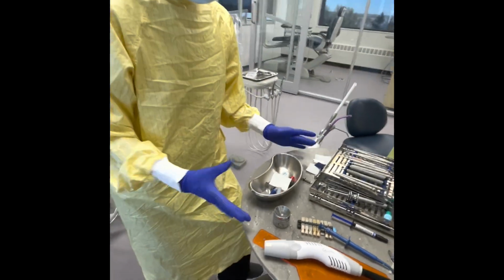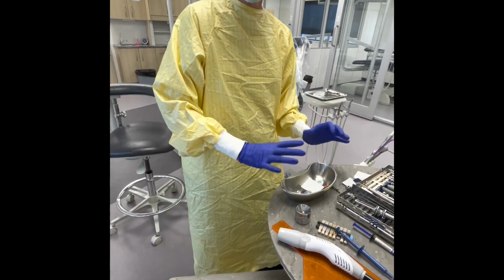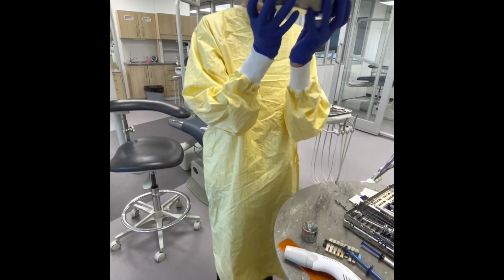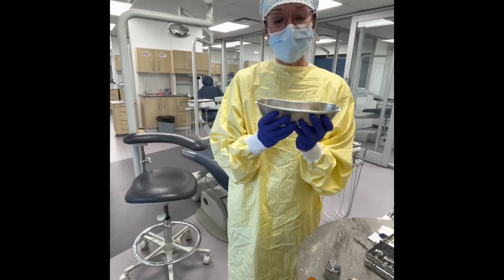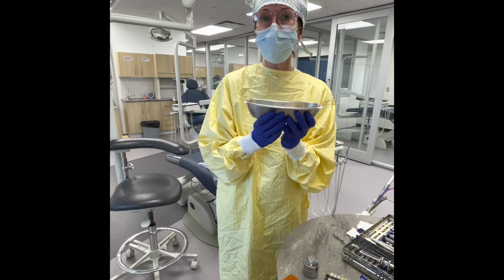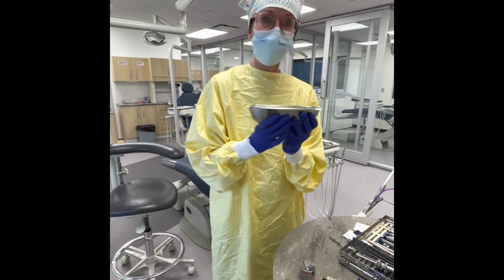Now what I'm gonna do is pick up my kidney basin. I'm not gonna put my fingers in there. That's dangerous because there's sharps in there. I'm gonna pick it up like so and hold it like this. And I'm gonna head to the Steri Center where we have our chemical hazardous waste and our sharps waste that I will put these in.